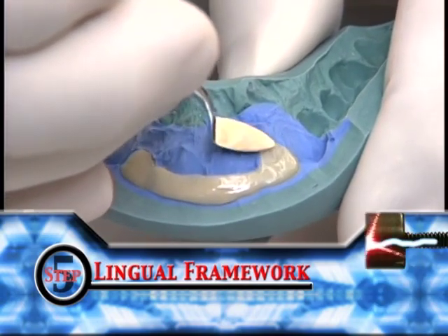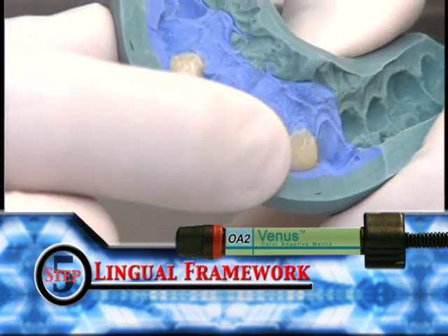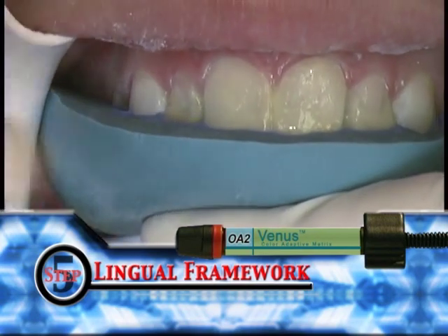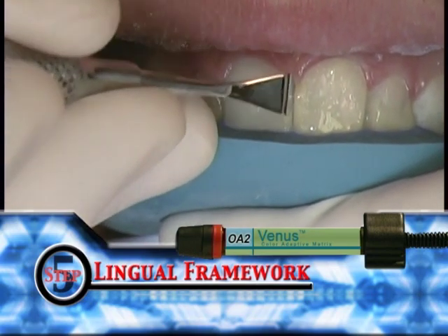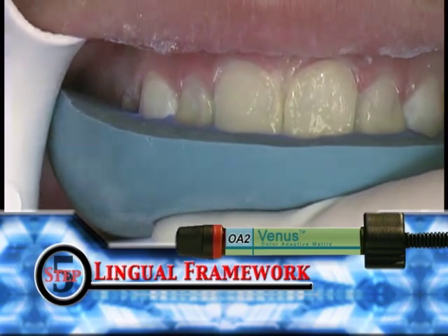In this case, we are using Venus Shade Opaque A2, also designated as Venus Shade OA2. It is important to take the opaque material all the way to the edge of the index, which will ultimately be cut off. You need a composite which does not easily set under ambient light. The longer working time of Venus is ideal for shaping the veneer in the index and placing it on the tooth. Once the composite has been placed, remove the excess opaque material off the teeth.